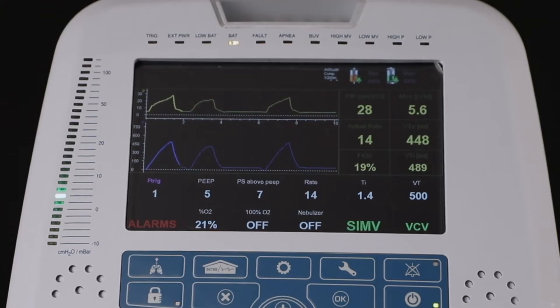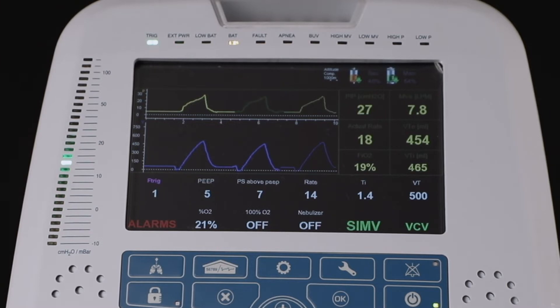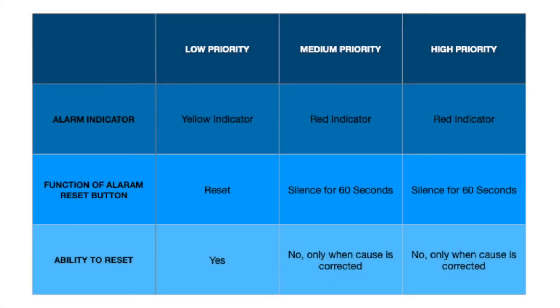A green battery LED indicates that the ventilator is connected to an external power source, while an orange LED indicates that the ventilator is running on battery. The display of an upward arrow indicates that the battery is charging, and a downward orange arrow indicates that the battery is depleting.